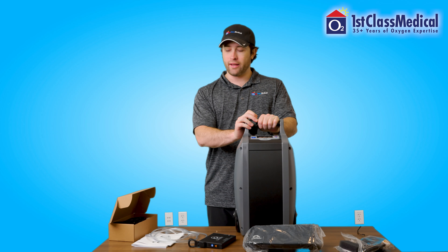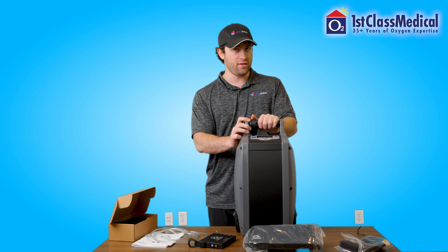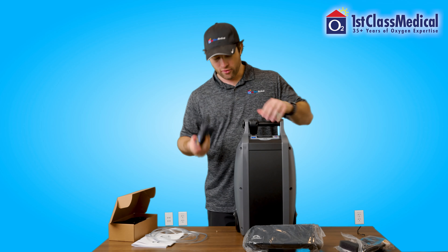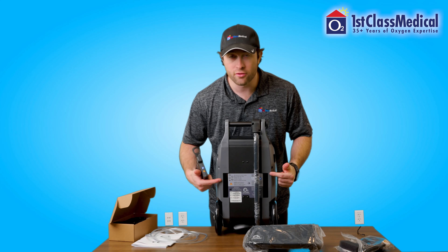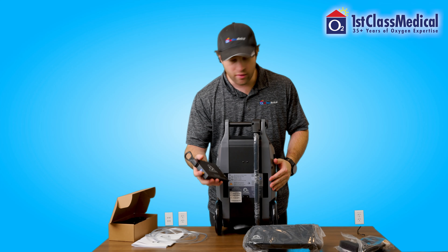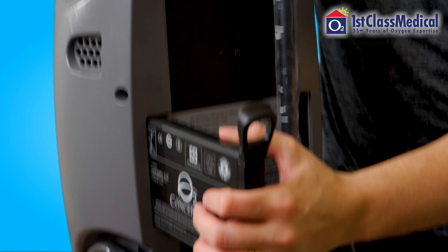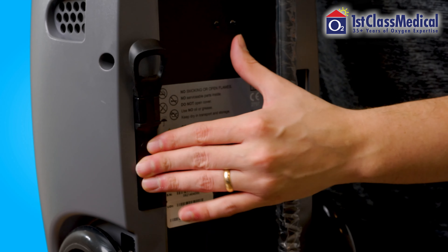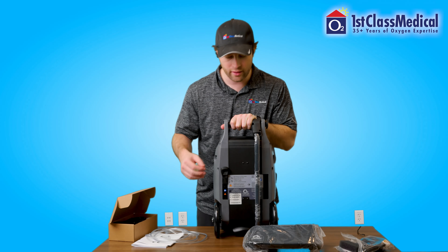Now that we have everything laid out, we're going to go over how to set up the O2 Concepts OxLife Independence for first time use. Starting with the rechargeable battery — in the back of the unit, you're going to notice there are two slots. These two slots are where the batteries will go. You can run the unit off of just one battery or two. It slides in and it will click. You have a little handle here to be able to pull out the battery easily.